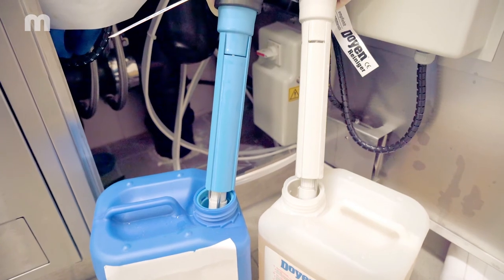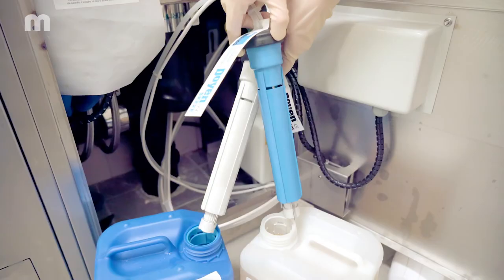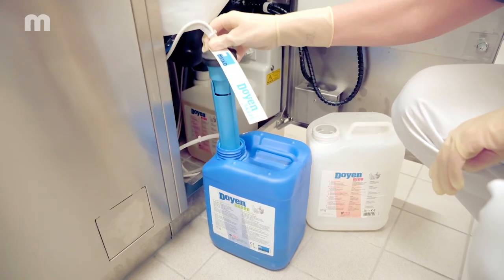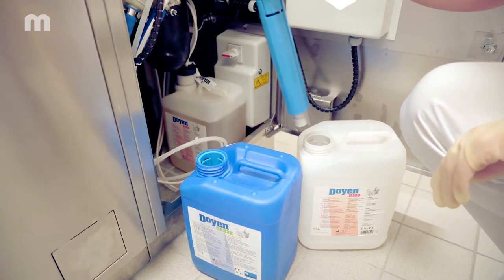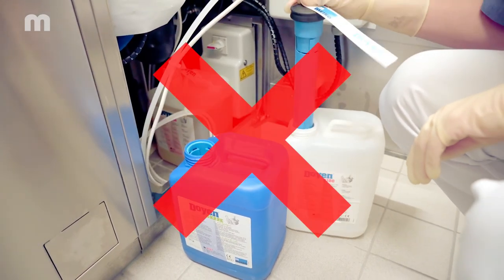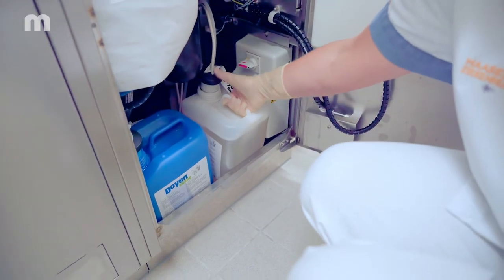Make sure the suction lance is standing upright in the canister. If you are using detergents and/or rinse aids from MEIKO, the MEIKO ChemCode system ensures that you never accidentally confuse the detergent with the rinse aid.